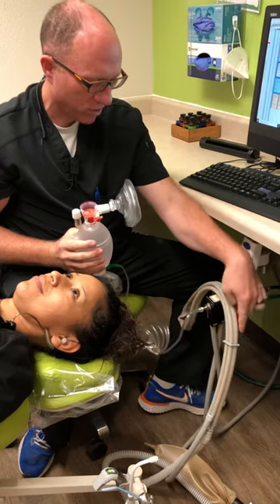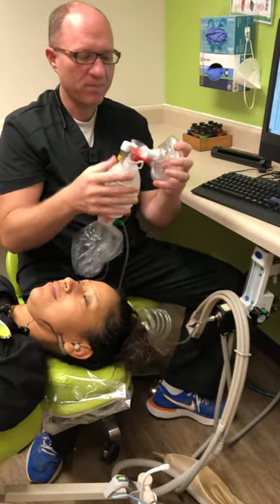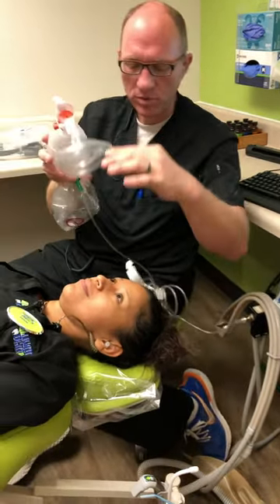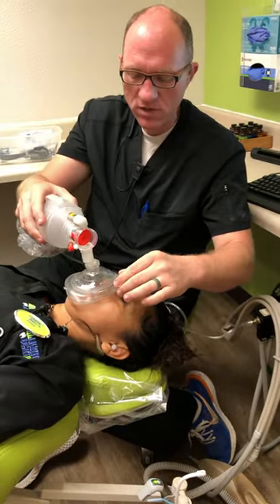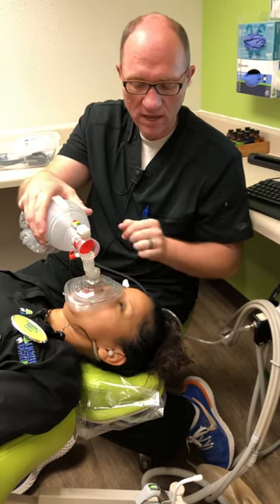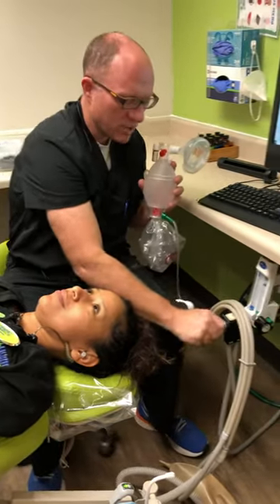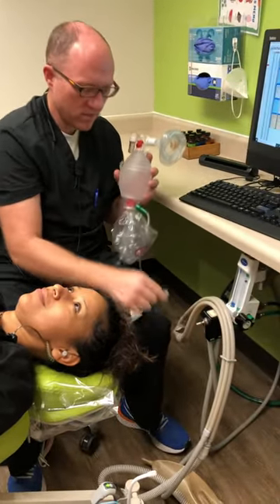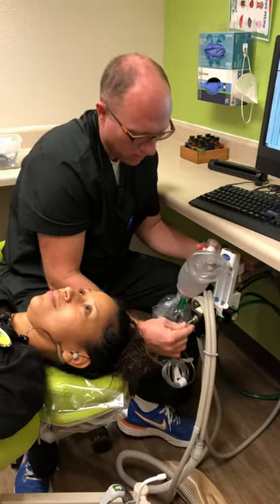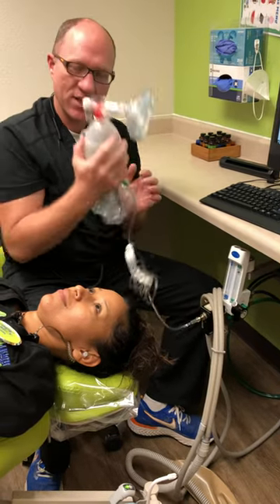Once that's in place and you turn this on, oxygen will begin to flow into the Ambu bag. Then this will be handed to the doctor, who can place it on the patient's mouth and nose, and begin to ventilate the patient — pushing in and out. So again, the attachment comes off, this slides on firmly, and then oxygen is turned on and it'll begin to flow. That's how you set it up.